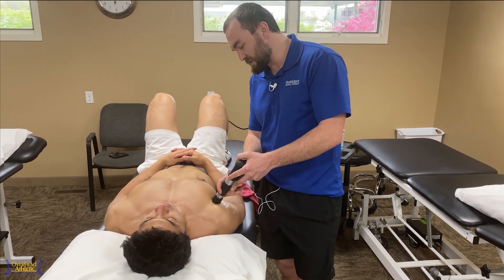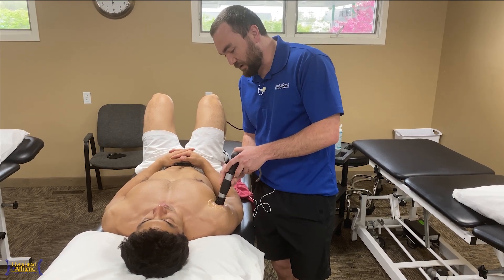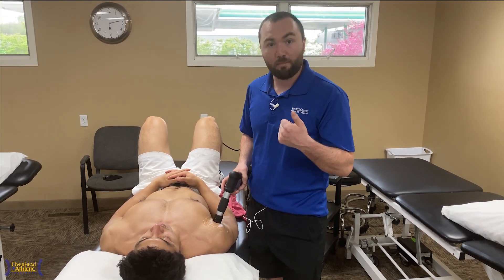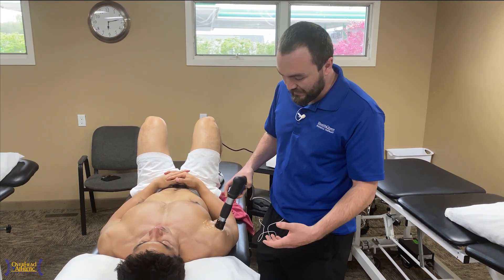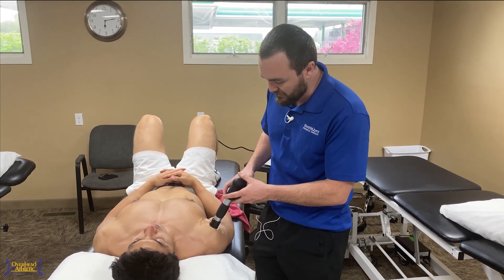So just something we can use as an adjunct to decrease pain, but also at the same time induce some healing and improve blood flow over the biceps tendon and anterior capsule, which is often strained in our throwing athletes. In addition to that, working on some of the anterior shoulder where maybe even the bursa comes in if you have impingement and those sorts of things.